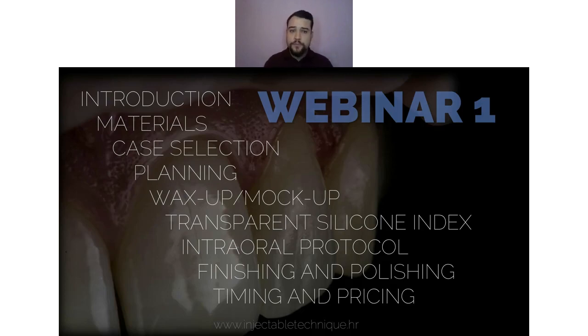We go into more detail about case selection, how to select your case, the indications, contraindications, and so on. In detail, we describe the whole planning phase, from dental photo and impression registers, how to plan everything, to do the facial analysis, DSD, how to prepare your wax-up, and which instructions to give to your technician.